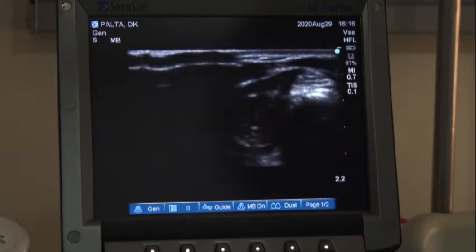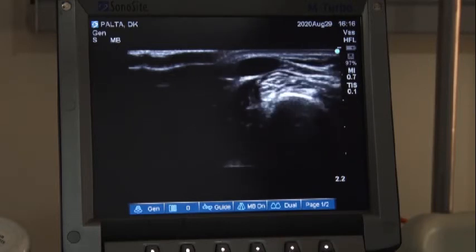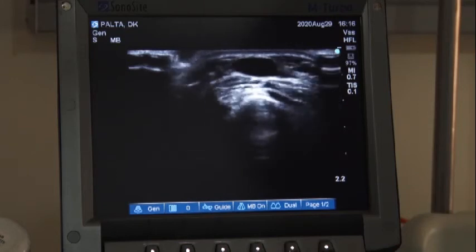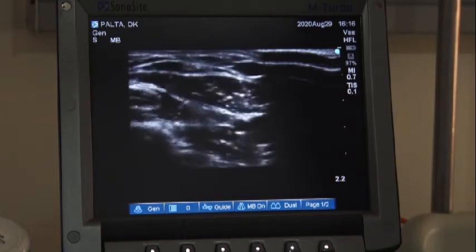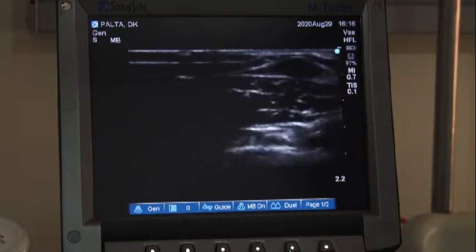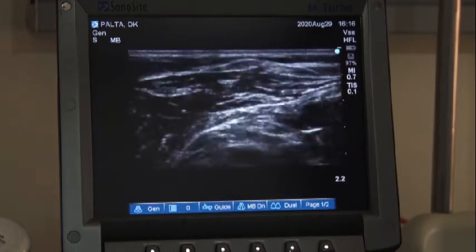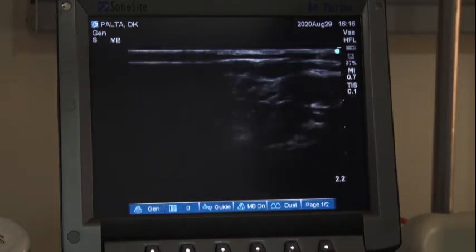One is going lateral to the arm, one is running in the middle of the arm, and again that branch is joining back to this vein and forming a single vein. I am screening it upward till the elbow. So at the elbow, this vein is joining again the median cubital vein and then breaking again into two.